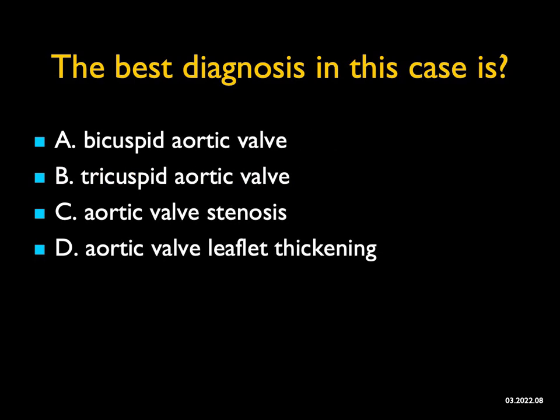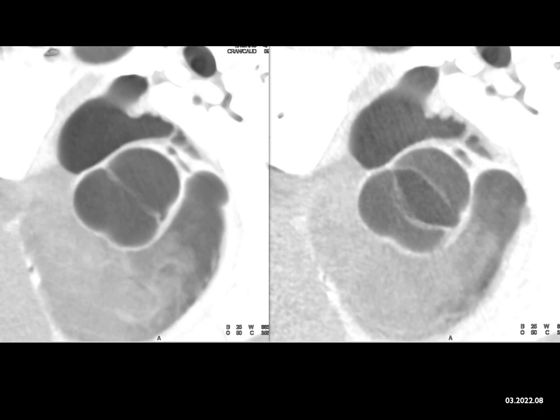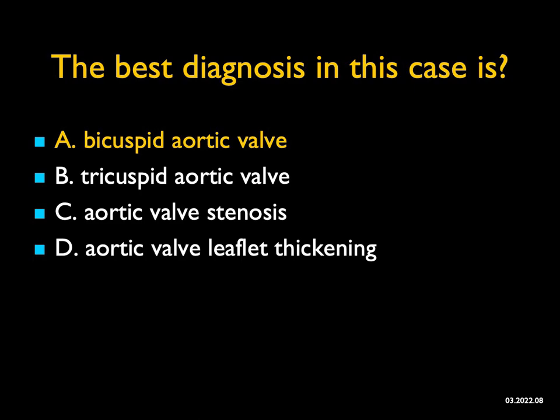The best diagnosis in this case is displayed very nicely. The image on your left shows a classic bicuspid valve. I'm giving you two sets of images with the valve open and the valve closed — a beautiful example of a bicuspid aortic valve. It's not the normal tricuspid, and it's not stenosis — there's no leaflet thickening. Patients with bicuspid aortic valve will get leaflet thickening and calcification 10 to 20 years earlier and will invariably need an AVR significantly earlier than a patient with a tricuspid valve. Certain diseases like Marfan's are more commonly associated with bicuspid aortic valves.